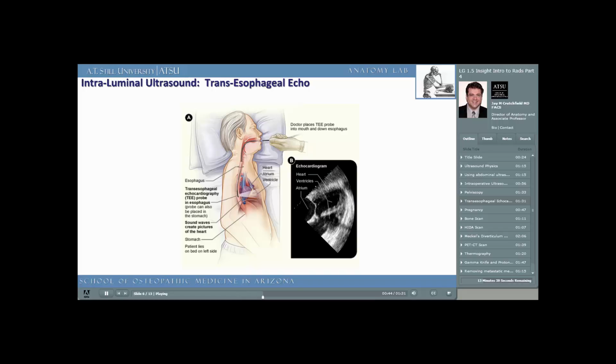Transesophageal echocardiography is more invasive than transthoracic external echocardiography. If I want to look at a patient's heart valves, we've already learned that there are several ways to do it. One, I can auscultate the heart with a stethoscope, which will give me an audio view of cardiac valvular function by listening for murmurs. Number 2, I can perform a transthoracic echocardiography through the skin of the chest.